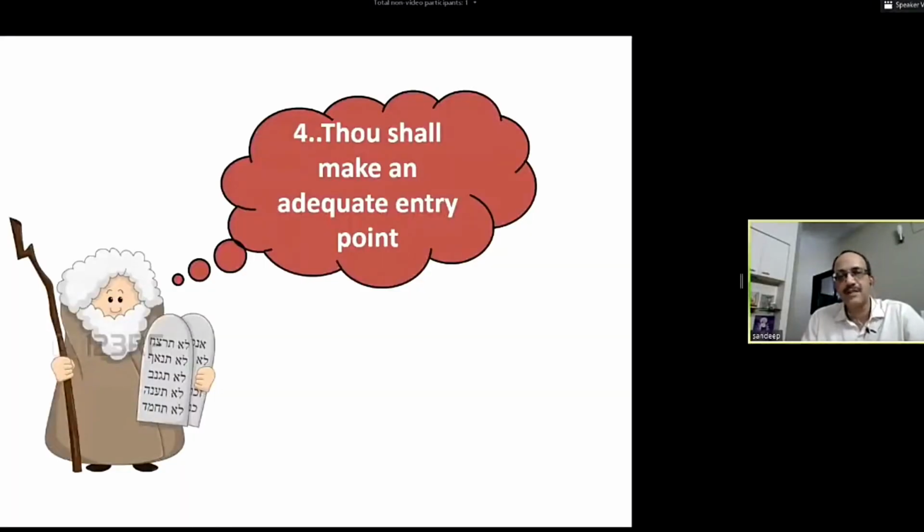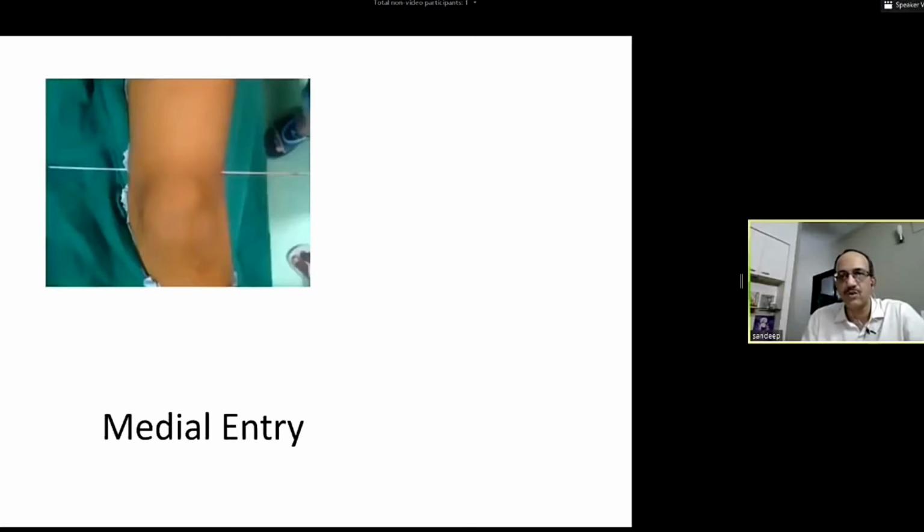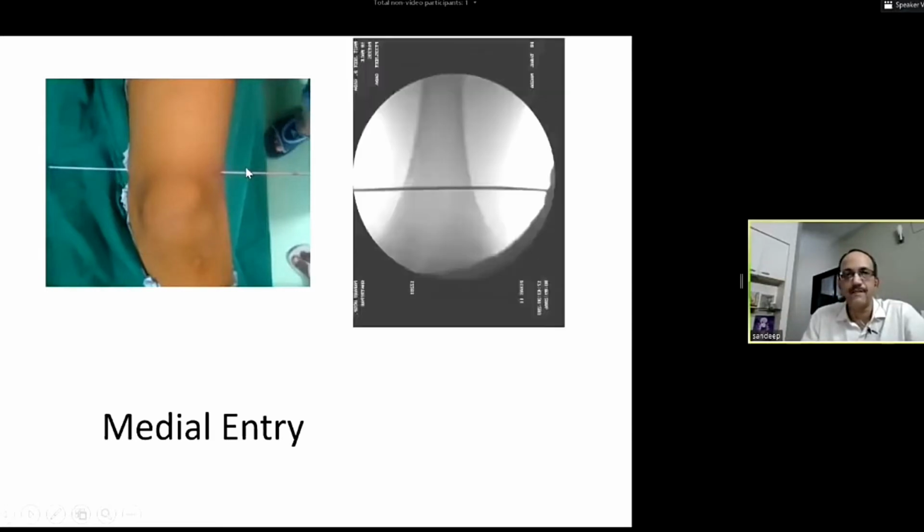The fourth commandment is that don't be very conservative with your entry points. Thou shalt make an adequate entry so that you don't struggle. The medial entry should be about 2 finger breadths proximal to the superior pole of the patella. On either side, you can have a symmetric entry point. You can pass a K-wire and drill over it, right?